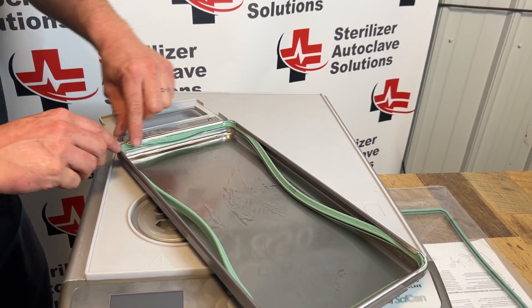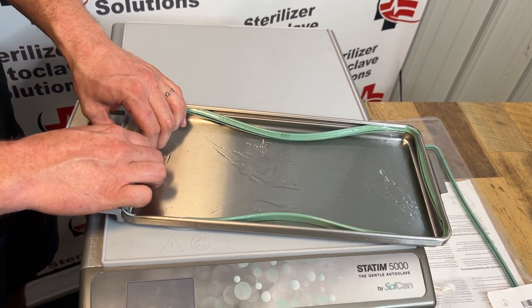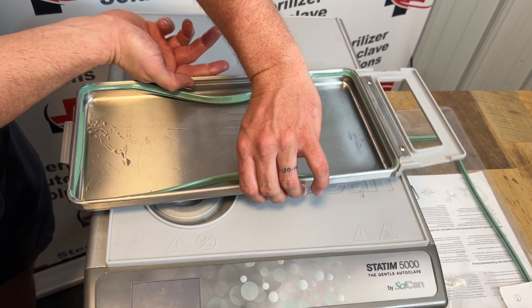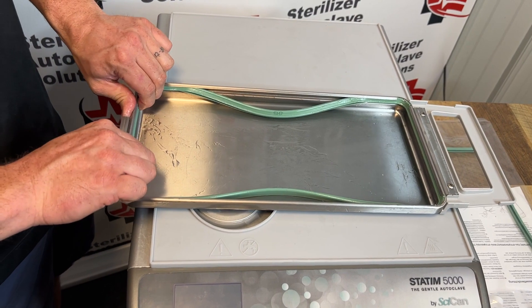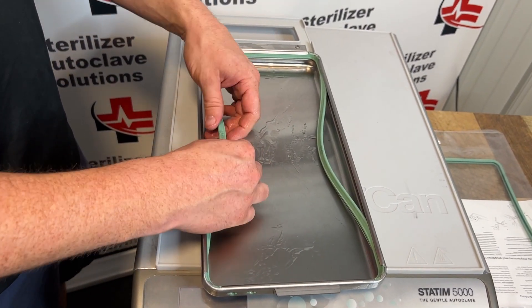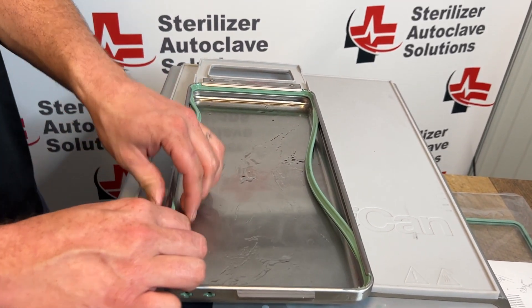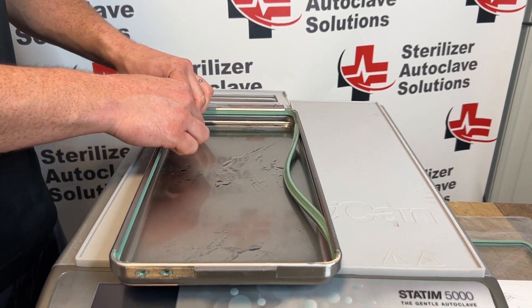Once all four corners are done and the nubs are in the corners, take it on the short side and press that in. Go to the other short side, press into place. When you get to the long side, split the difference right in the middle, press that in and work your way out. You will get bubbles — that is okay, it will slide into place.